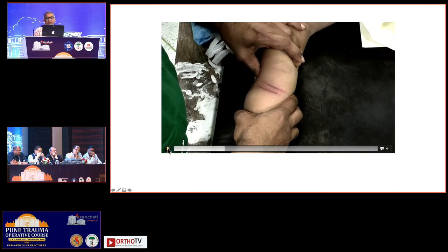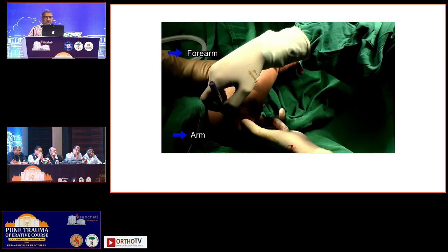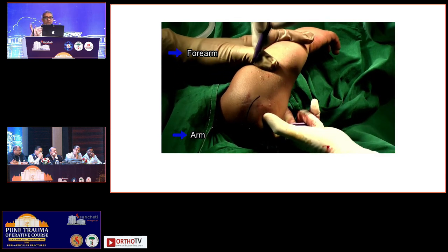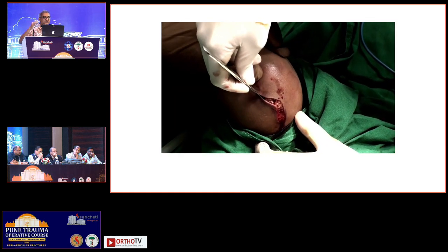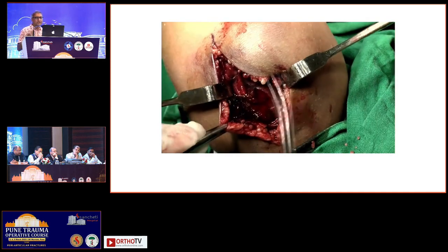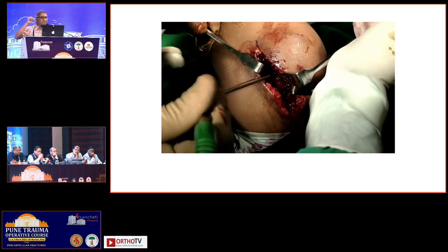The elbow would just move medially and laterally. So what we decided to do was go through a posterior approach, and I'm going to show you how we did that. This is on the table. The patient is in supine position, and you have to flex the elbow so that you can go to the back. So the position is very tricky here in the supine position. It's a curvilinear approach going close to the olecranon. And as soon as you cut the skin and the fascia and separate the muscle, immediately you see the fragment.